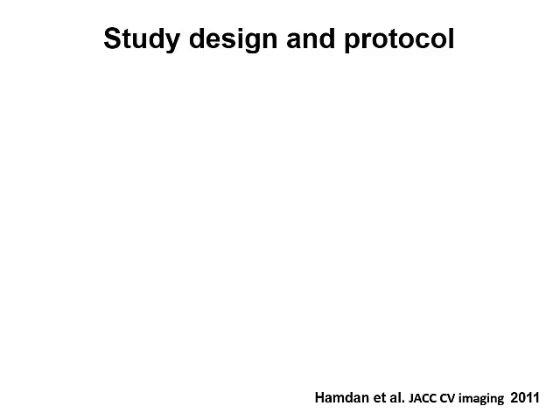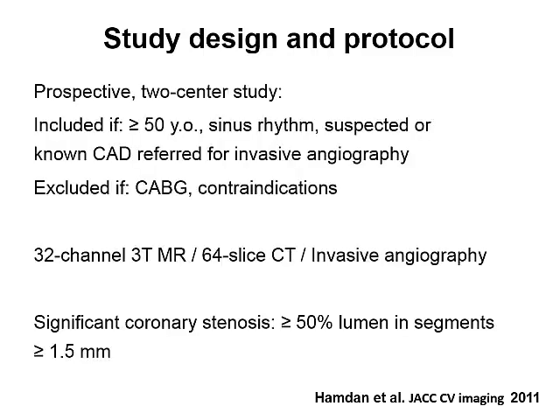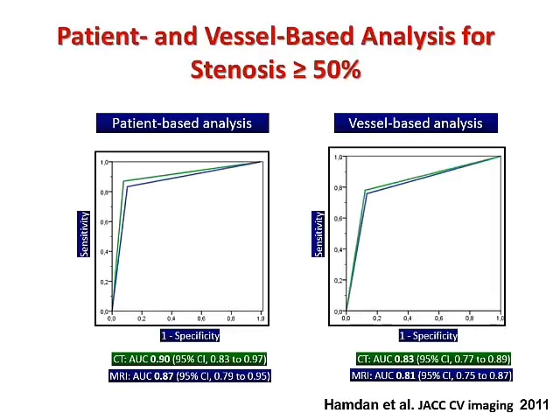During my fellowship, we developed at the German Heart Institute an MRI sequence which can perform coronary angiography very well. We compared the diagnostic performance of a 3 Tesla MRI with CT, where the invasive angiography was the gold standard. We performed a 2-center study, and we included patients with suspected or known coronary artery disease. I will show you the result of the study.